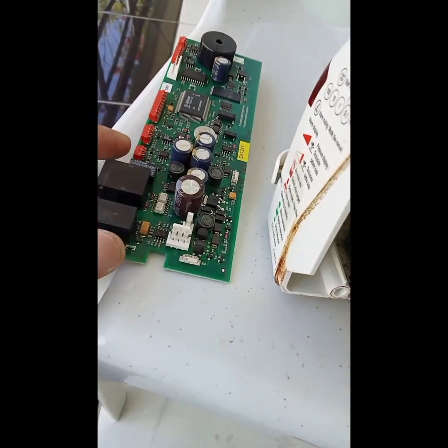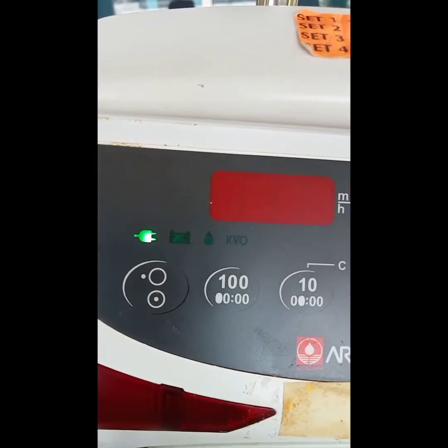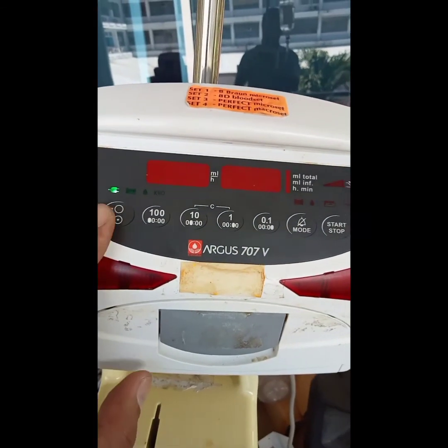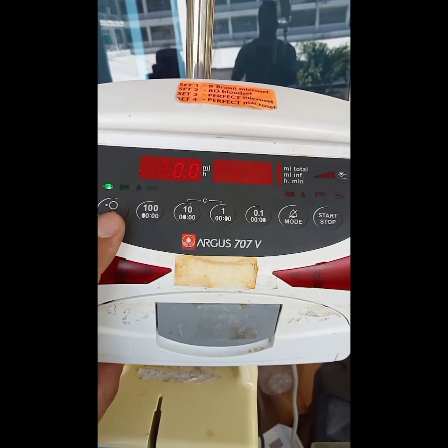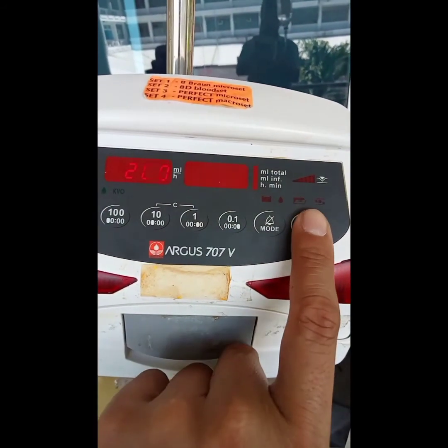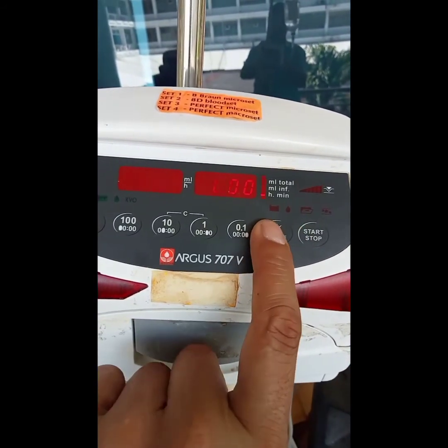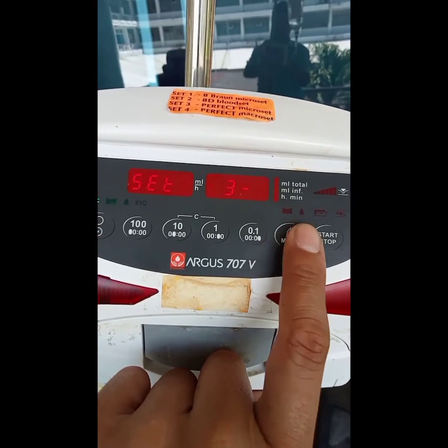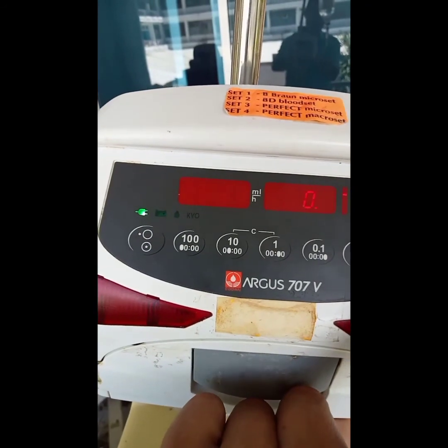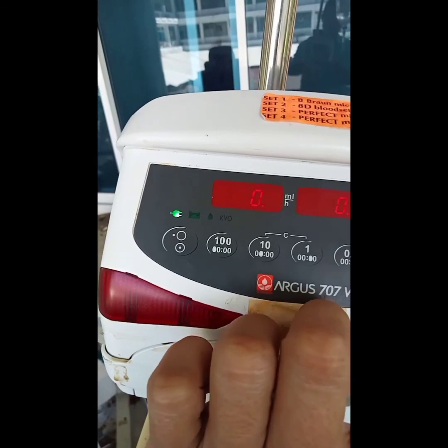Okay, Biomeds. Okay, we're going to switch on this Argos 707. Okay, here we go, and I think it is now switching on. And the next thing to do is to test and charge the battery for at least 8 hours, and we're going to calibrate this one after 8 hours of charging.